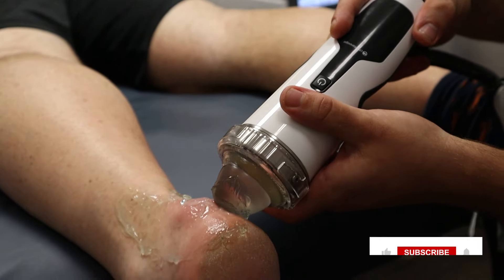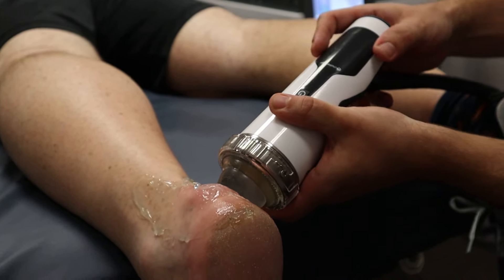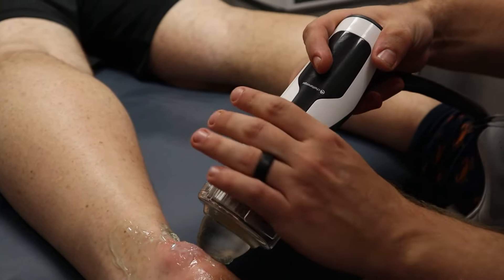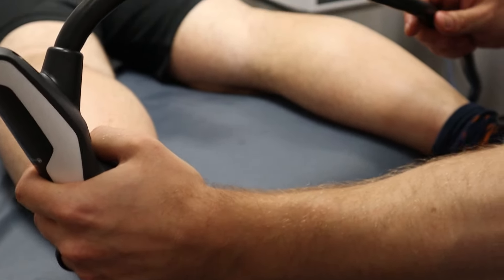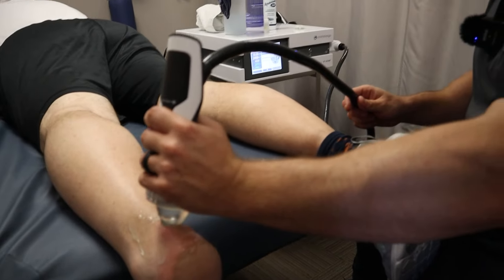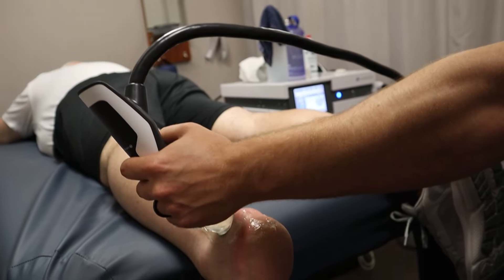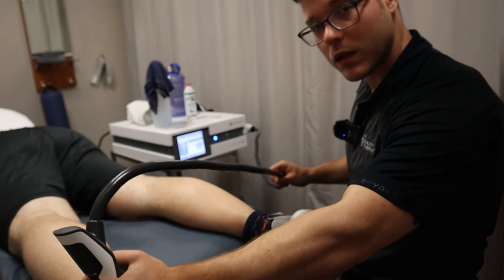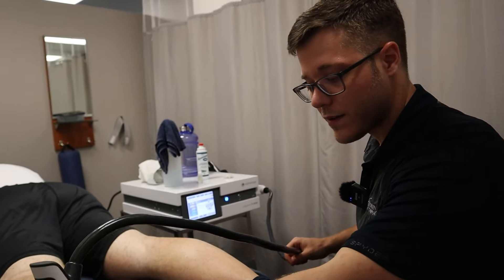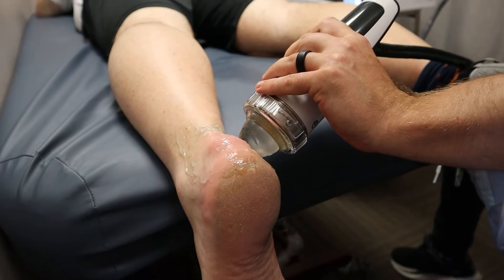How does the pressure feel so far? Not too bad? Perfect. So I'm going to go ahead and bring it up. Still feeling okay? Perfect. Now there is not a perfect answer for the pressure or the force that we're using. We just ultimately want to go for patient comfort level. You want to be a little bit uncomfortable, but we don't need the patient clenching for pain or starting to sweat because it's really hitting them. You don't need it that high. It's not a no pain, no gain situation — we just need you to feel a little uncomfortable to make sure it's working.